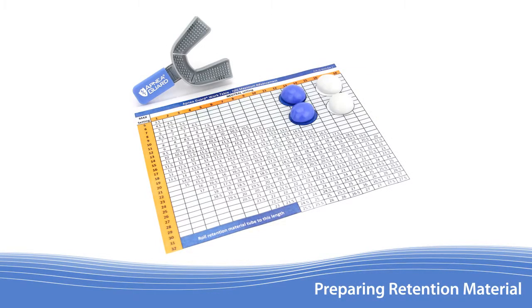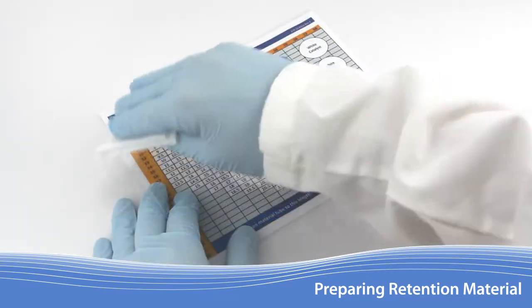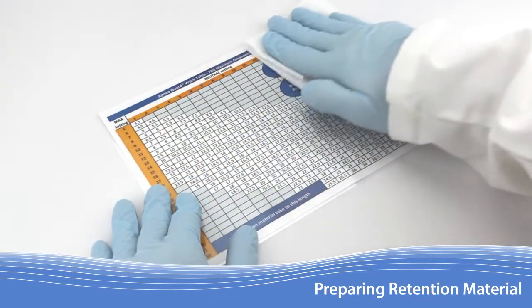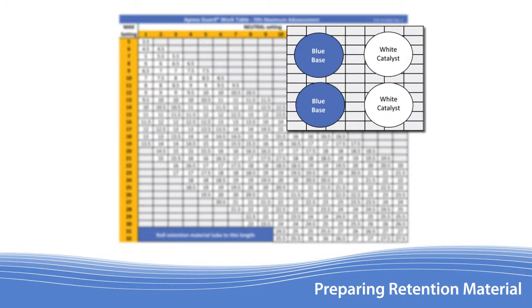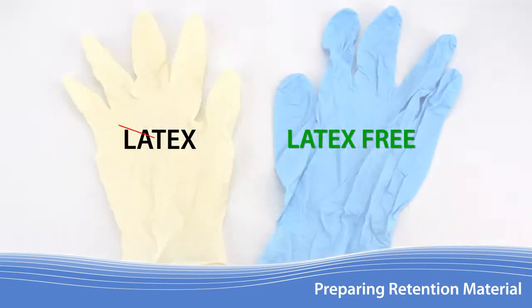Included with the Apnea Guard kit is a laminated work table designed to simplify the fitting procedure. Begin by sanitizing this table with an alcohol wipe. On the work table, you will find four circular areas to place the retention material in preparation for the fitting. The retention material will not set properly if it comes in contact with latex.